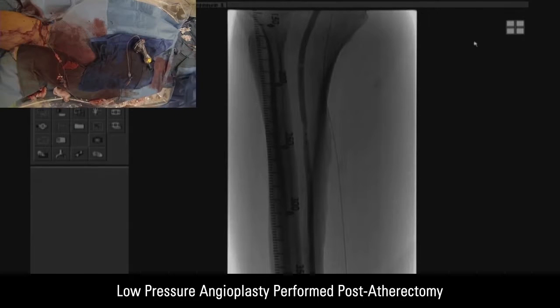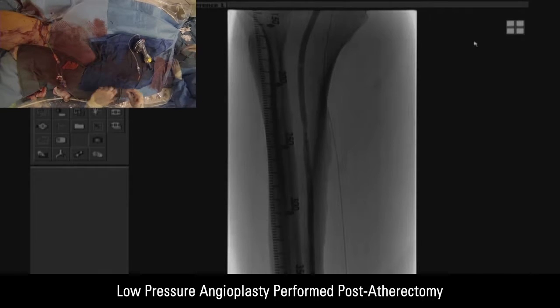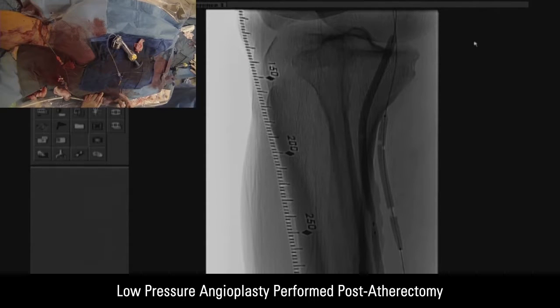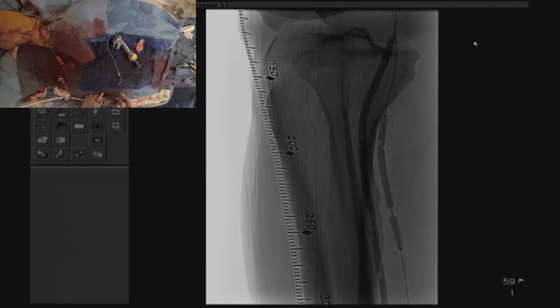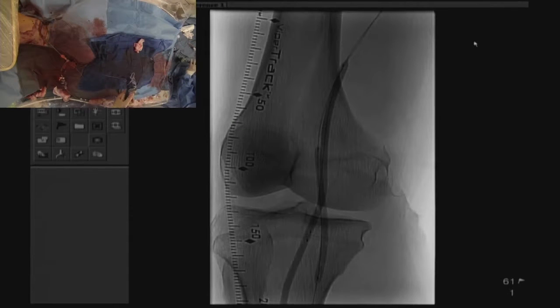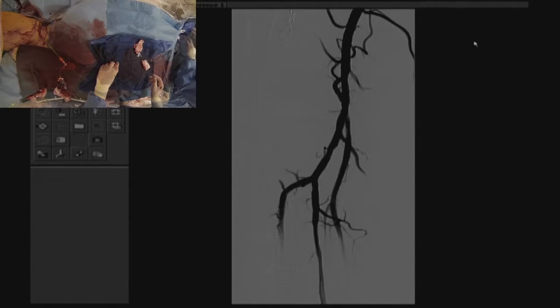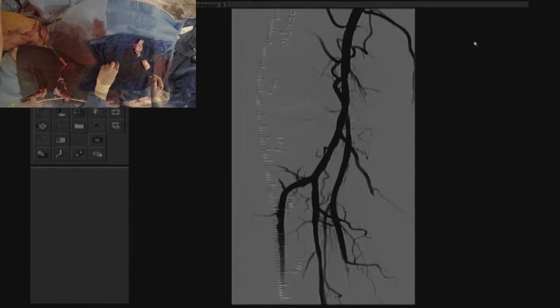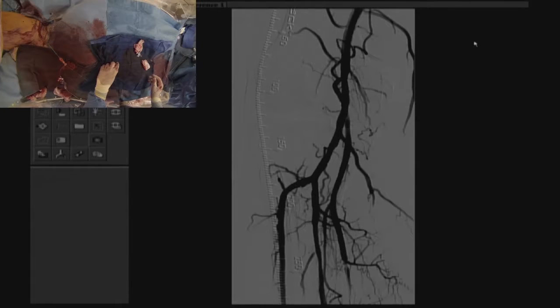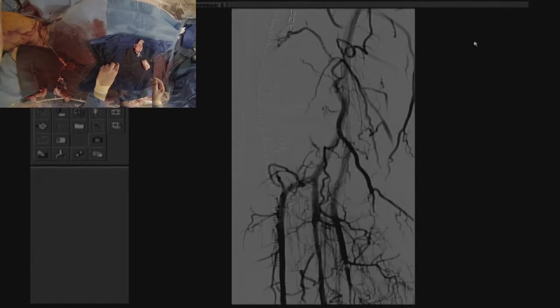The next step is to proceed with low-pressure balloon angioplasty of the popliteal artery, TPT trunk, peroneal artery, and posterior tibial artery. The advantage of having access within the posterior tibial artery affords the operator the capability of performing retrograde balloon angioplasty. Also, having an antegrade 7 French sheath, you can perform kissing balloon angioplasty of the popliteal artery and posterior tibial artery. This is kissing balloon angioplasty of the popliteal and posterior tibial artery.